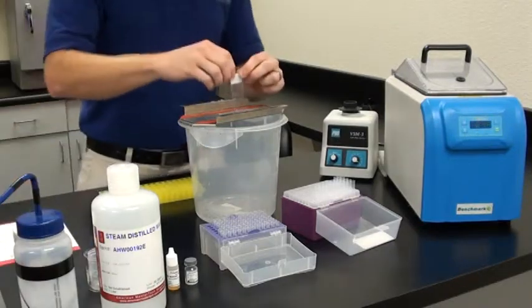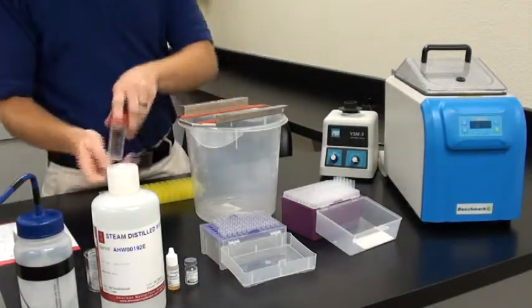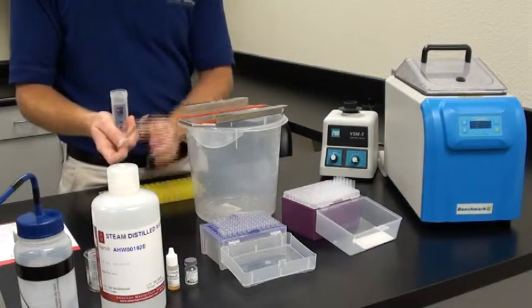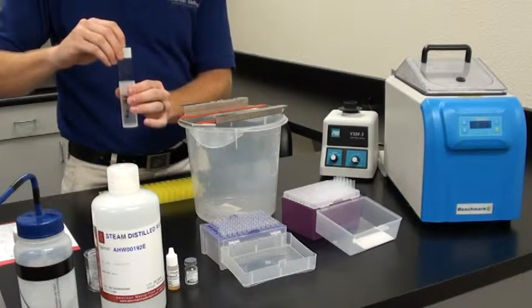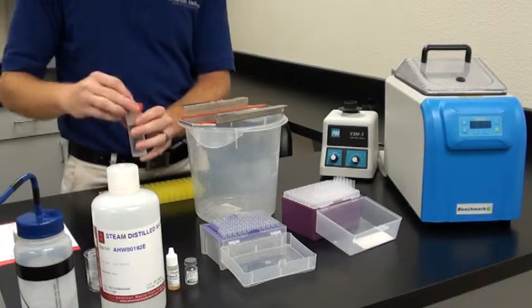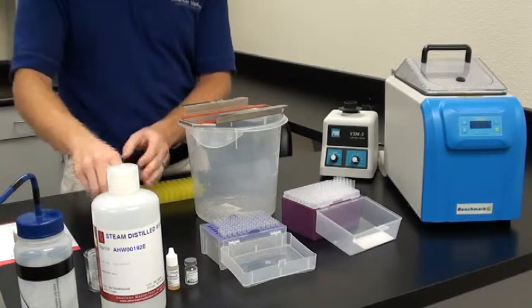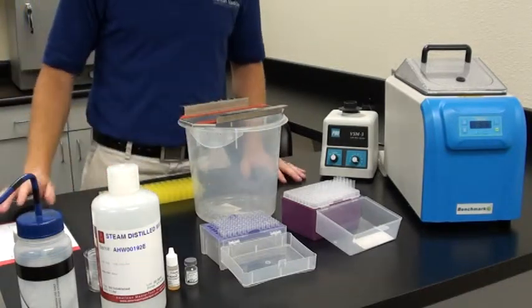Once we've rinsed the slide really well, we're going to put it back into the slide jar with PBS 7.4, and we're going to leave that in there for about 5 minutes.